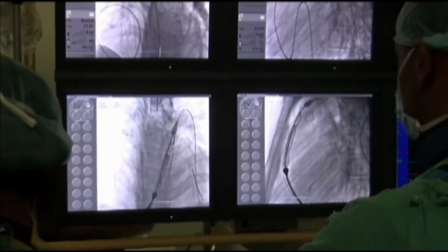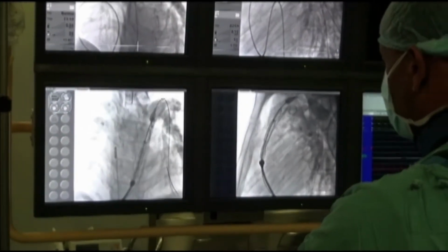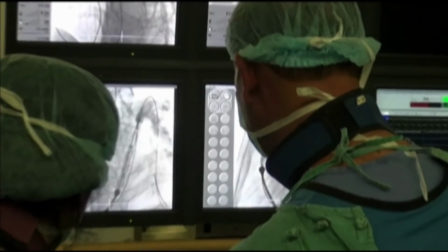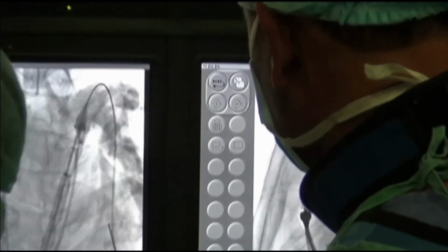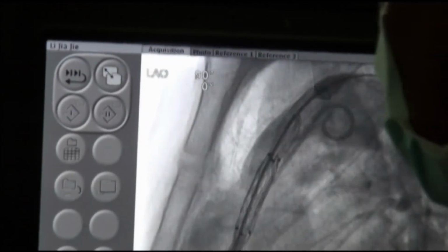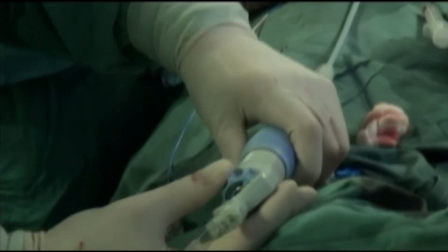So they speak Chinese. They say ready to do injection. Inject. So we are actually not bad because the MPA is right there. So with the angio, we can adjust for the tip position. If it is too high, we can bring it back a little bit.